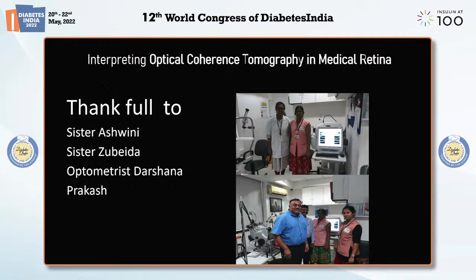You are working in such a setup where you have everything in place. But for people who are working remotely, or who have just a fundus photograph, these silent clinical features can help them. Definitely. But the most important take-home message, irrespective of my lecture, is to start screening your patient with a fundus. Because unless and until you scan your patient for it, there is no awareness about it. Even as we were discussing before the initiation of this session, the patients say, I can see everything, it's completely asymptomatic.